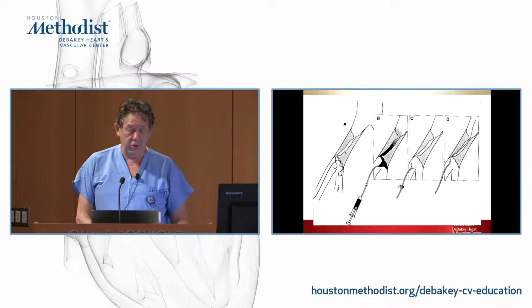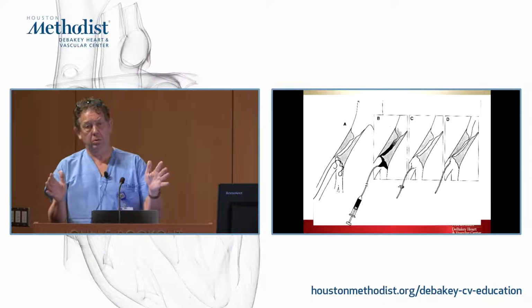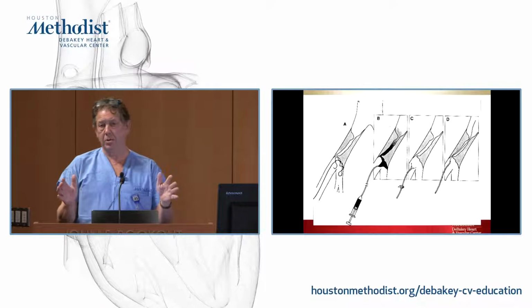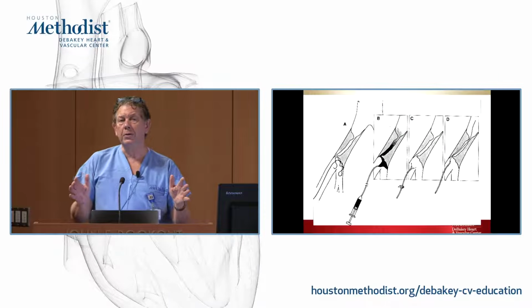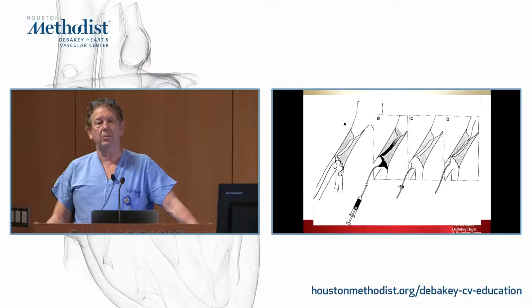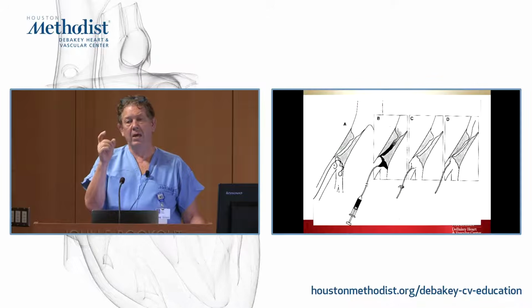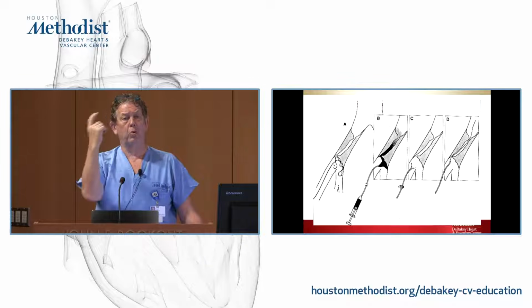What you really don't want to do is jam this thing up there. It goes here, because then it tracks right up inside the wall of the aorta. And when you fluoro and look at this, it's going to look like the wire's inside the aorta. The clue that you've got subintimal is when you spin an angled wire, and a wire in the lumen moves freely.